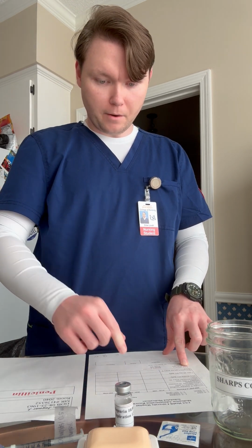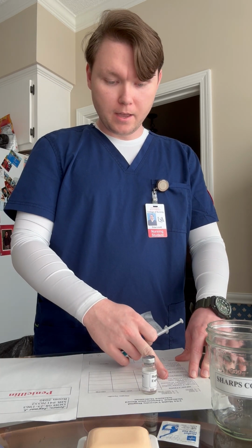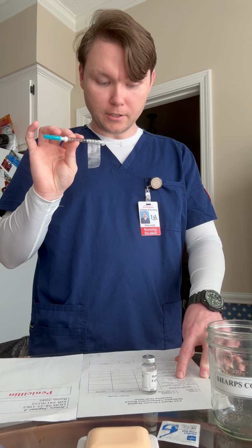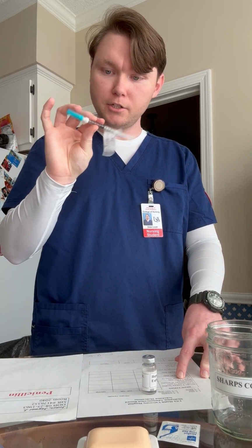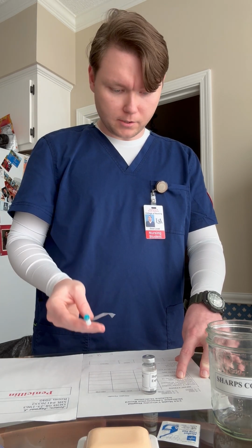All right, so now I'm going to start my last set of medication accuracy checks. So I have Jaguar J. Jones, all right. Right medication: I have heparin ordered, and I have a vial of heparin 10,000 units per milliliter, and I have heparin 5,000 units in 0.5 milliliters in this syringe. Okay, my right route is subcutaneously. I have the correct needle and syringe for a subcutaneous injection. Right dose is 5,000 units. I have 5,000 units in 0.5 milliliters in this syringe here, and I'm just going to double check that. I have 0.5, which is 5,000 units, okay?